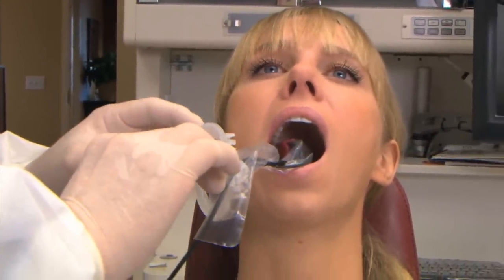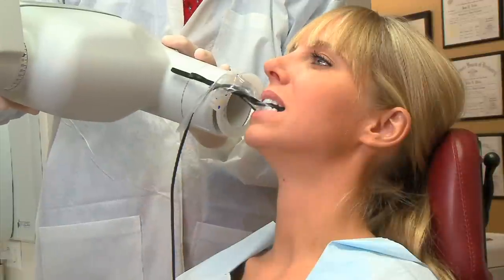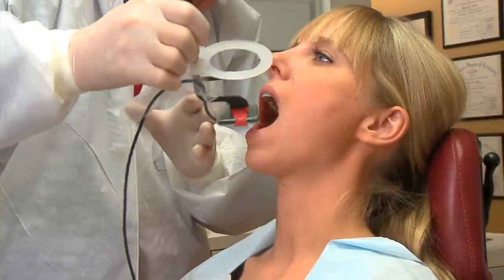Move forward to the premolar position and tell the patient to close gently. Align the cone with the aiming ring and take the x-ray. Flip the holder for the other side and follow the same procedure.